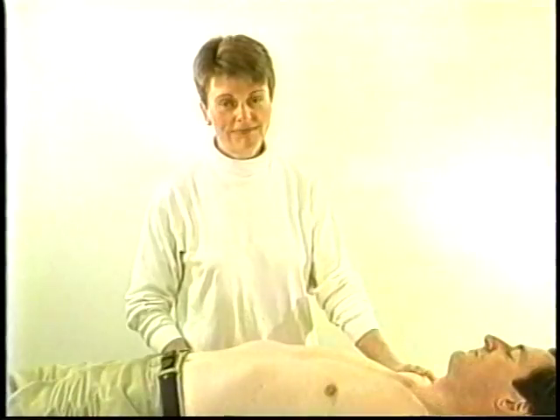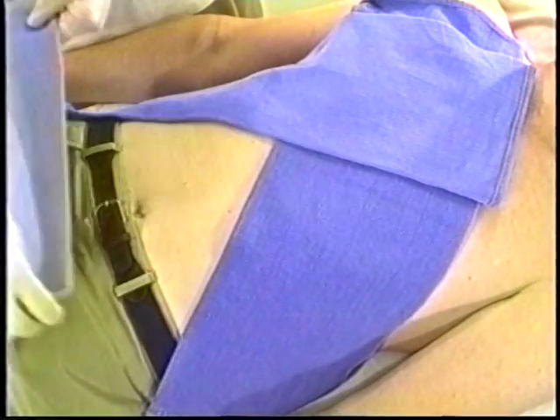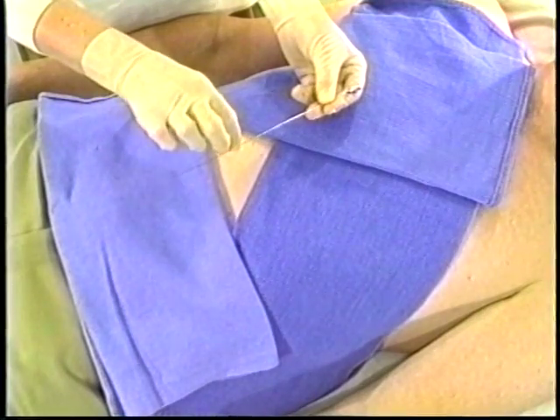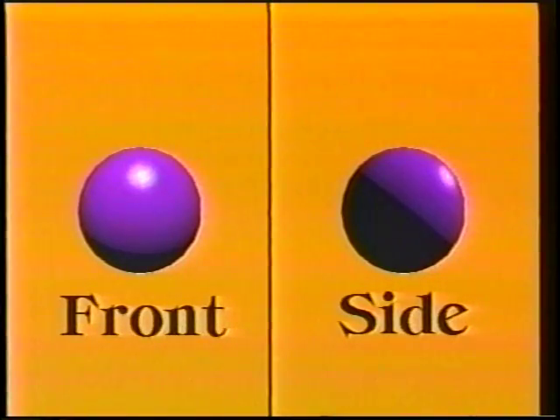It may be better to ask the patient to come back after 1 to 2 weeks for an additional sampling or to do an open biopsy. When sampling deep, non-palpable lesions, visualized by radiologic image or by ultrasound, I suggest a slightly different approach. After the skin has been cleansed thoroughly, the area is draped with sterile towels. Sterile gloves are used so that both hands can be used to guide the very pliable needle as it travels through the tissue. Now it is time to check the position of the needle.